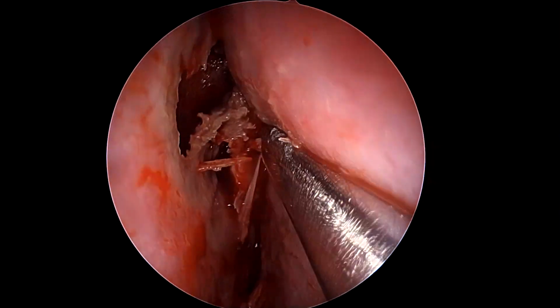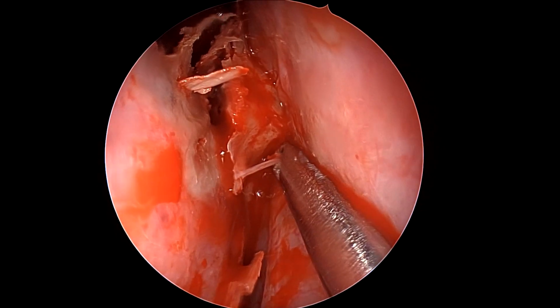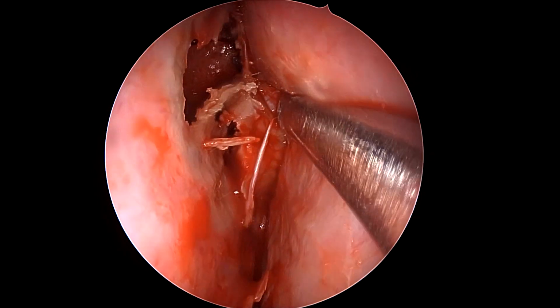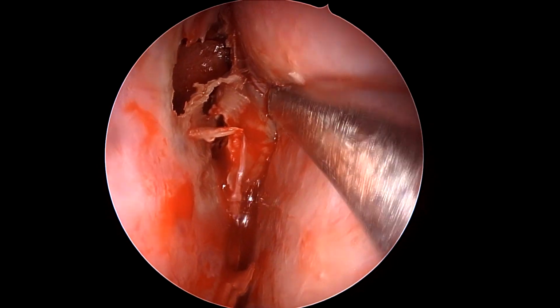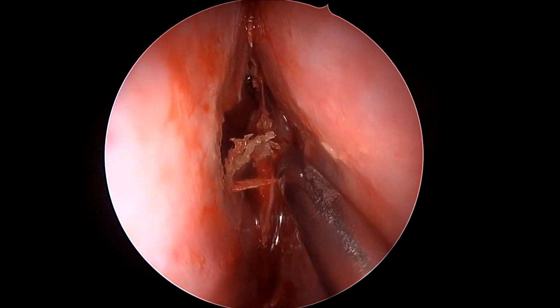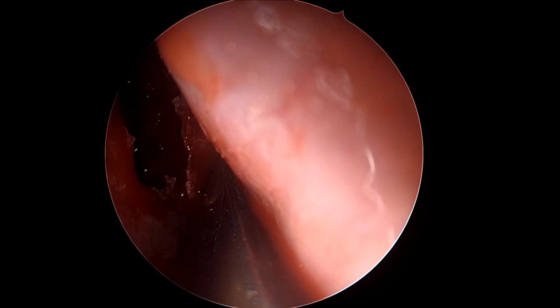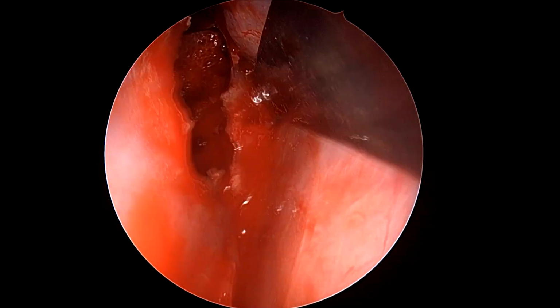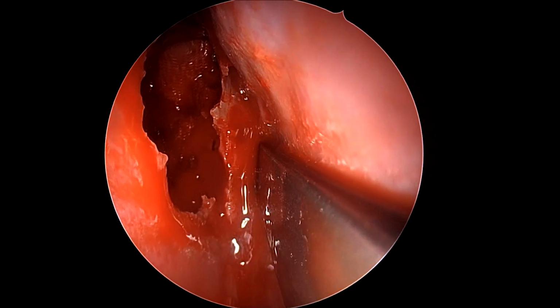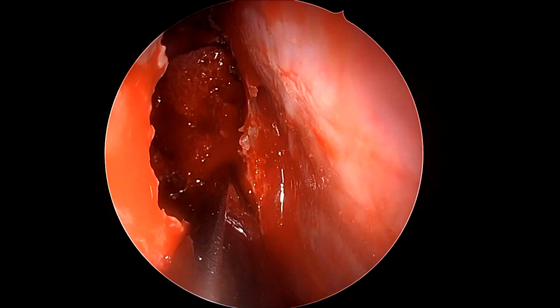Now see, we have come to the rostrum, and what we are doing here is elevating the septal flap off the rostrum and displacing it laterally so that we can access more of the rostrum. And once we remove this rostrum, we get to see the sphenoid from both sides, on the right side in a total way, on the left side in a halfway, which means through the septoplasty incision and not in contact with the lateral nasal wall, thus conserving the lateral nasal wall in this kind of surgery. It also conserves the septal flap on this side because we do not take off any septal mucosa on the left side. We'll put this entire septal mucosa back just like it is.